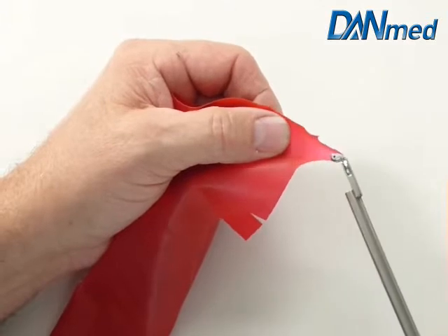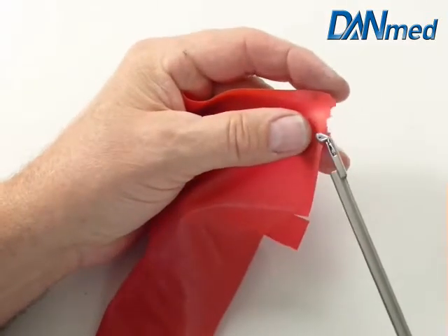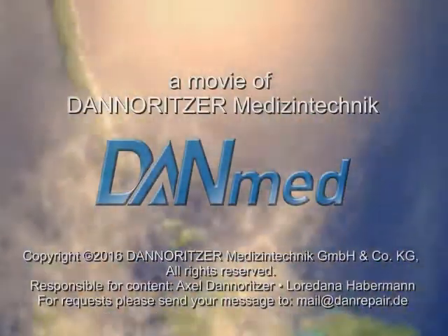Now we grab a rubber band and test the grip.